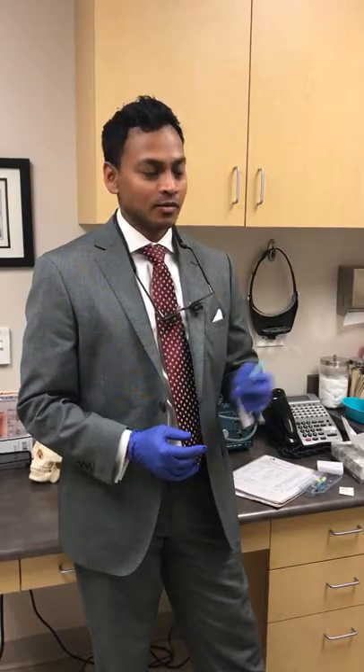I'm Dr. Christy Agraja here at Park Avenue Oculoplastic Surgeons. Today we're going to be injecting Volbella in the lip in one of our patients. Volbella is great — it's a smooth, syrupy-like filler, and it's great for giving volume and almost wetness to the lip, along with treating the area above the lip where you can get vertical lines. It's something we commonly do here, so let's get started.